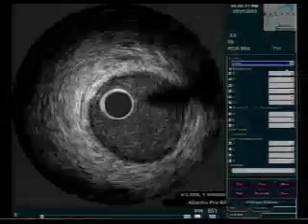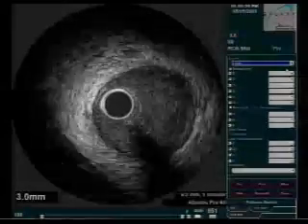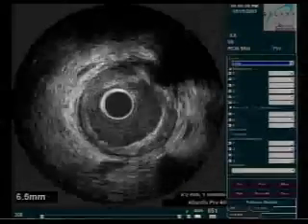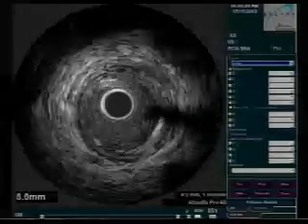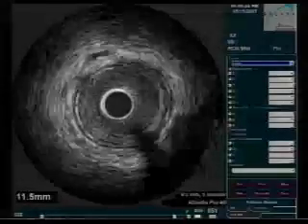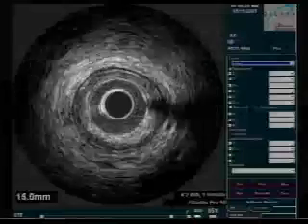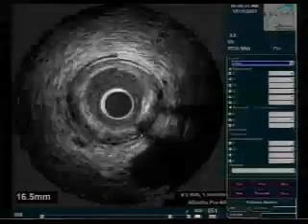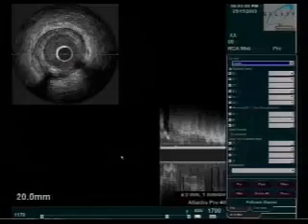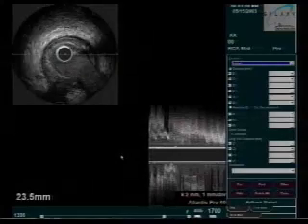We're going to go ahead and start the pullback now, and the catheter and its camera will slowly pull back inside the artery, and we'll see plaque developing on the outside. So now if we start about 1 o'clock on the artery wall, and go down to 6 o'clock, we see some plaque develop. There's a thin rim of calcium, very bright. If we go to live feed now, I'll just show with the cursor on the screen. Now we see a large area of concentric atherosclerosis building up in the artery. I've put a split screen up now. We see the cross section in the upper left-hand corner, and we see the artery laid out in long view in the bottom right-hand corner.